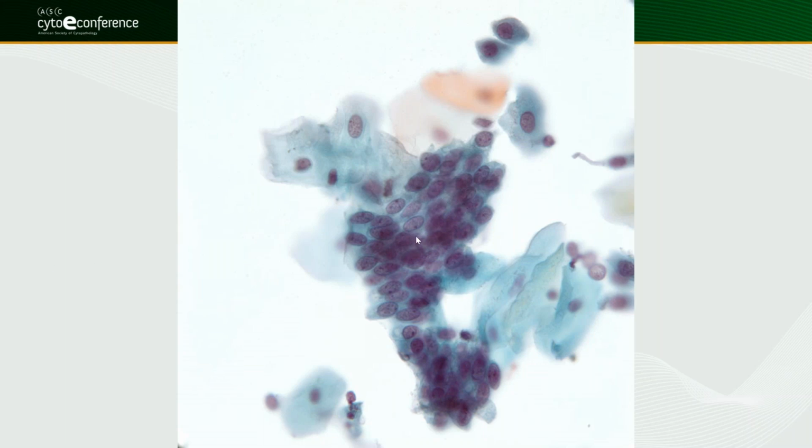It's more crowded, but they still have little nucleoli, and there may be a little acinar structure here. So there is some architectural atypia and some hyperchromasia, but overall it's not too bad. So this can be put in the atypical NOS category.